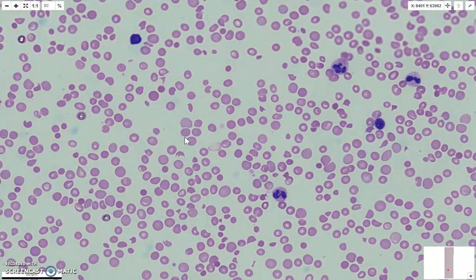And by having these occlusions there, your red cells that are trying to pass through that blockage are actually being mechanically sheared into these fragments. So what we see here are fragments, or what we call schistocytes. Now Rebecca has said that they're sort of pizza-shaped. I'm trying to find one here. There's one right here. The pizza-shaped fragment or schistocyte.